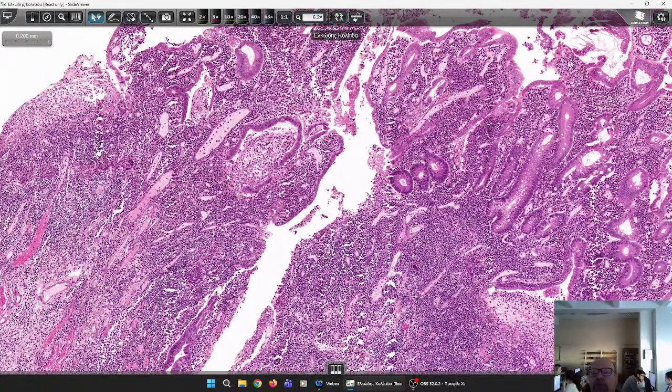It is not consistent with Crohn's, because Crohn's wants granulomas irrelevant to ruptured crypts. If you see a granuloma close to a ruptured crypt, this is not typical of Crohn's disease. It can happen in ulcerative colitis. And here you see again the architectural disruption. You see this irregular shape in this crypt. Take a look here.